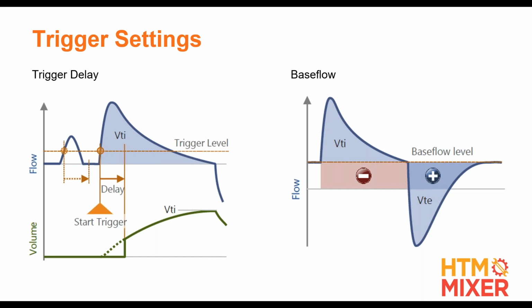breath. It's usually, I think, like 30 to 60 milliseconds that you have a chance to set that. So again, if you have a very noisy signal, really bad test lung, really bad ventilator, you can set your delay to kind of clean that up.